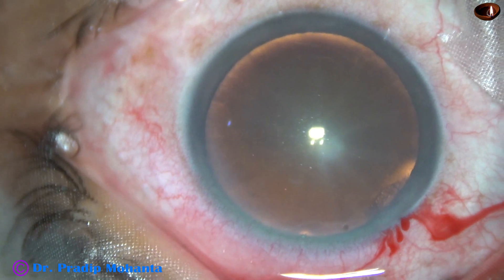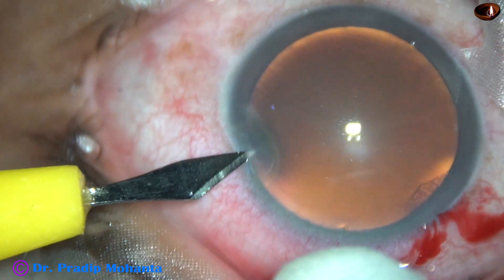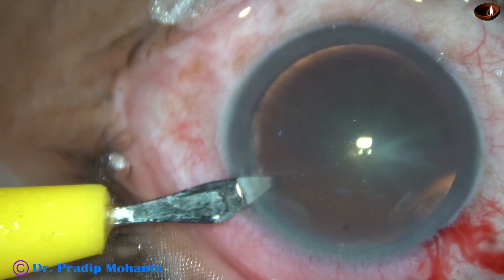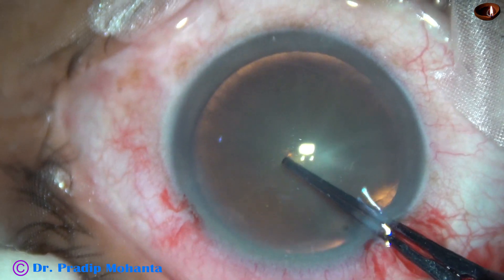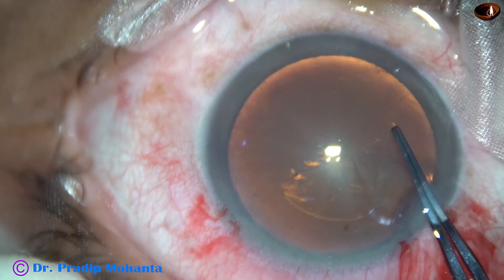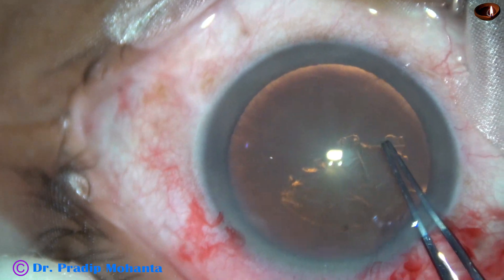We can see a spoke pattern of the lens mass. This is a side port on the left side of the main incision, about 3 clock hours away. When you place the side port 3 clock hours away, the astigmatism induced by the main incision is neutralized to some extent by the side port.